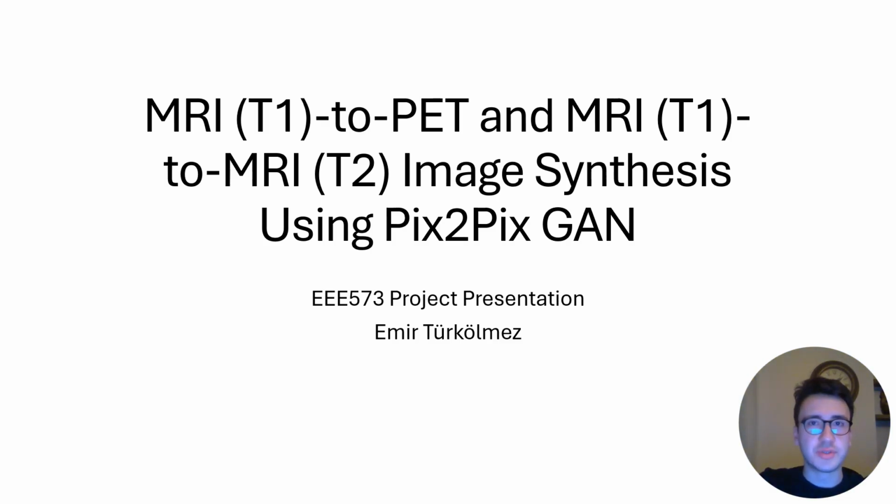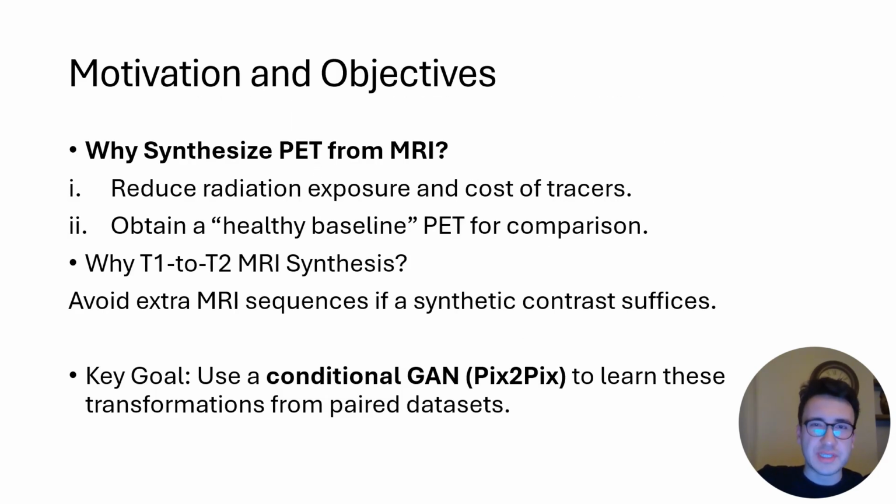Hello everyone. Today I'd like to present my EEE573 project about MRI T1 to PET and MRI T1 to T2 image synthesis using Pix2Pix GAN, which is a conditional generative adversarial network. So here are the motivations of this project.